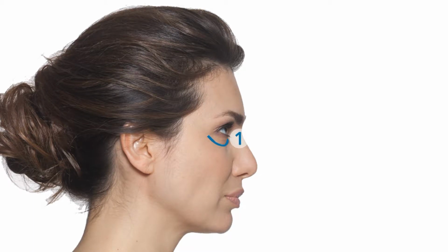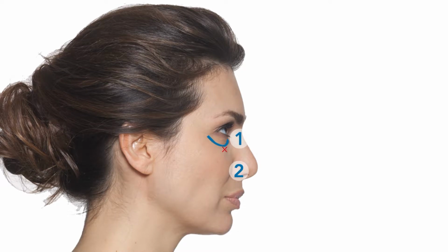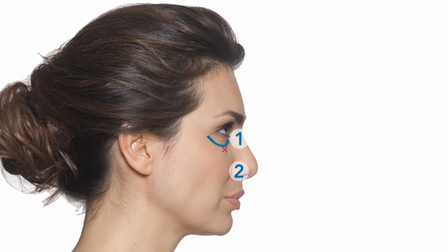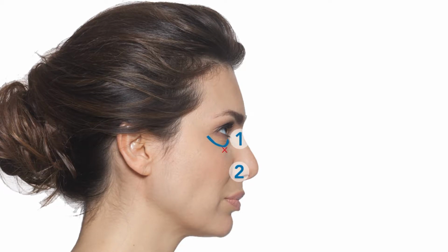Mark the infraorbital foramen 2. Its location is usually 5 mm below the inferior orbital rim and in a vertical line with the patient's mid-pupillary gaze. Use a cotton-tipped applicator to find this subtle depression under the skin. Ask the patient to verbalize when they feel nerve irritation.